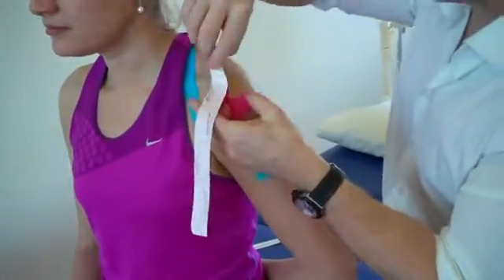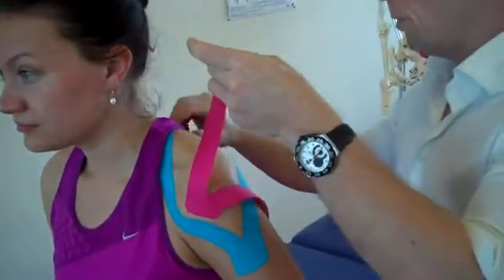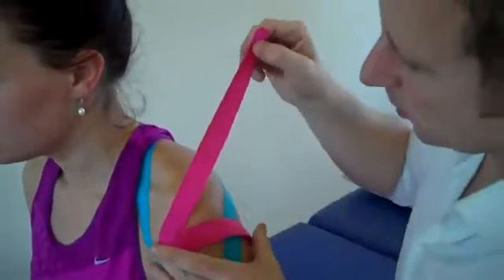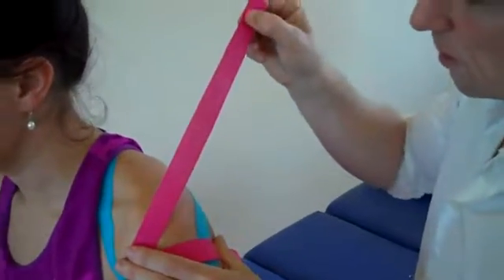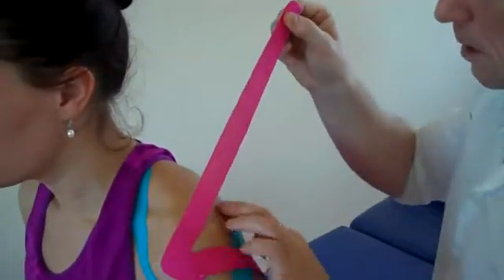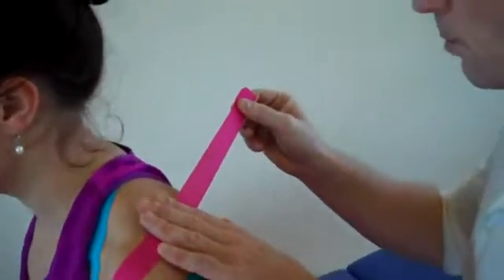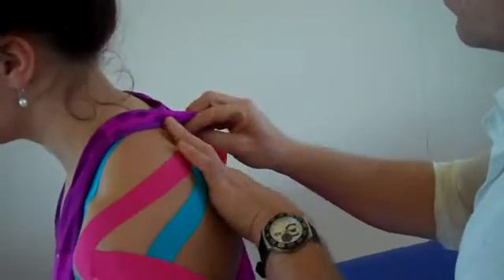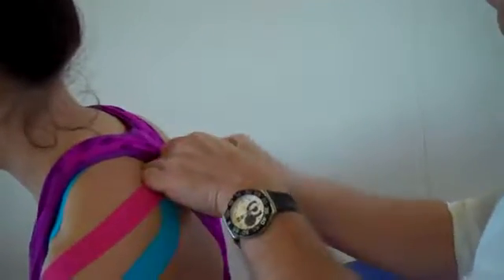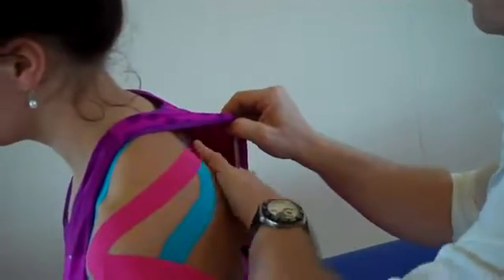Peel back one of the legs — no stretch on the end. Bring your shoulder back a little bit. We've got 100% stretch, ease off a little bit to 80%. Find the spine of the scapula and literally just slightly above it where the supraspinatus will come round — just feed this under, and feed it round. That's the first piece.